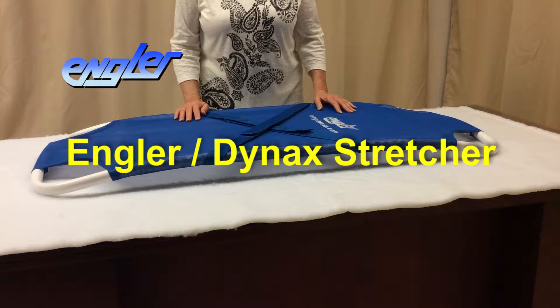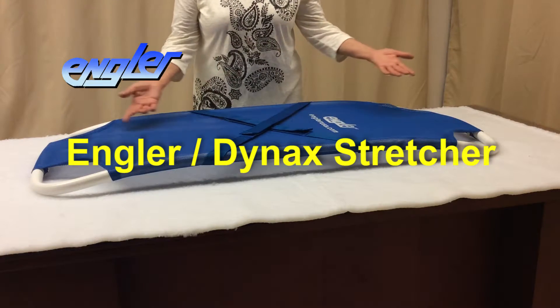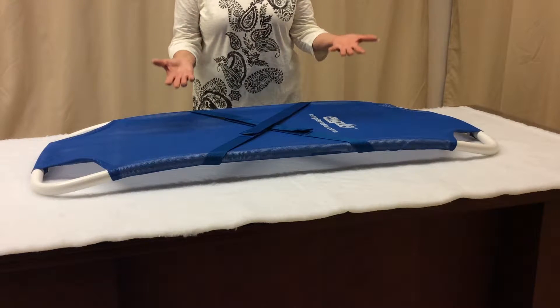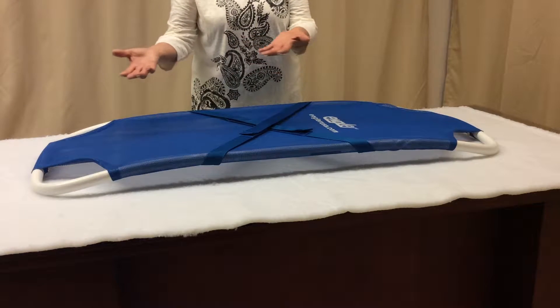Our Dynax stretcher is one of our most popular items. It is the number one veterinary stretcher in the world. It is designed to aid the veterinarian and staff in lifting and transporting the immobile patient from the car throughout the clinic or hospital.